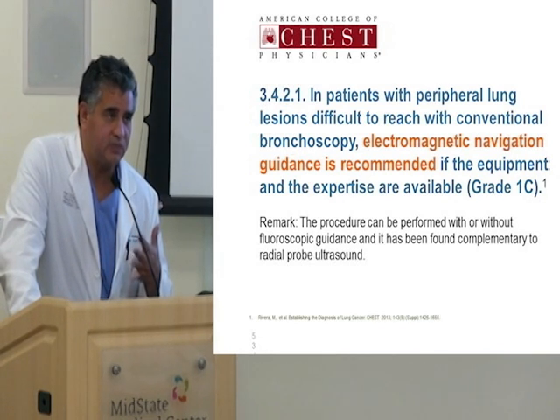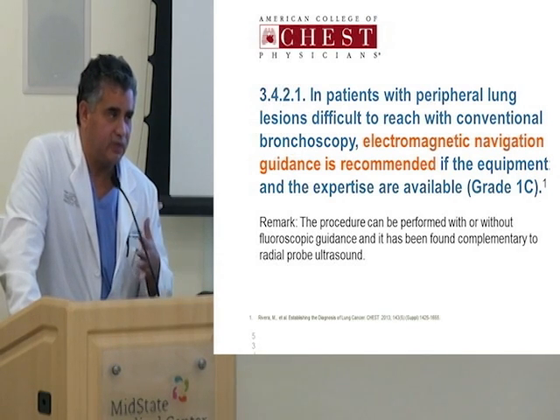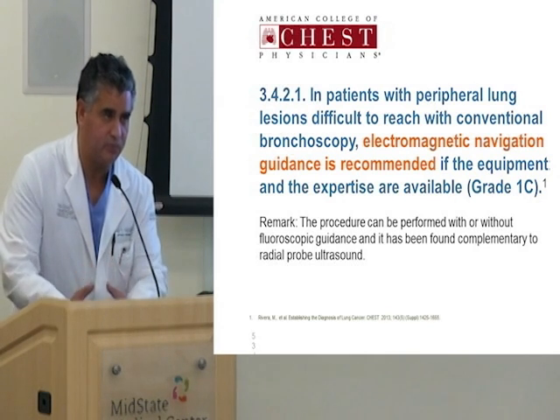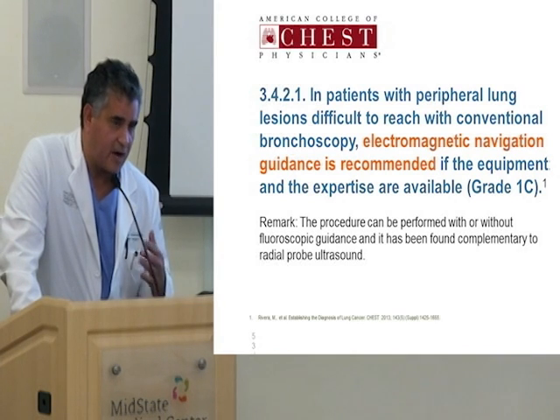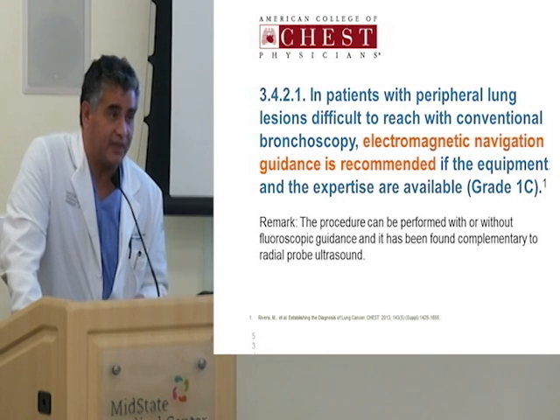If CT-guided biopsies have a 5 or 10 or even 15% pneumothorax rate, the pneumothorax rate for navigational bronchoscopy is less than 1%. If there's a 1, 5, or 10% rate of bleeding, however you want to judge it based on the severity of bleeding, the chance of bleeding with navigational bronchoscopy is literally an order of magnitude less. And so if we can even approach the types of diagnostic yields, I think we all go by the Hippocratic Oath, first of all, do no harm, and we try to do the more minimally invasive thing first and build up to the more invasive things. And I think that's probably the best reason why navigational bronchoscopy should start taking its place as the more common way to approach these nodules. We won't get the answer all the time, but certainly we do it at a much less risk to the patient.